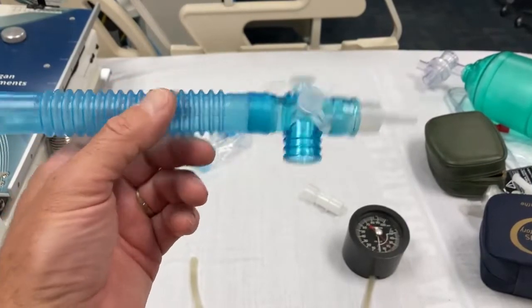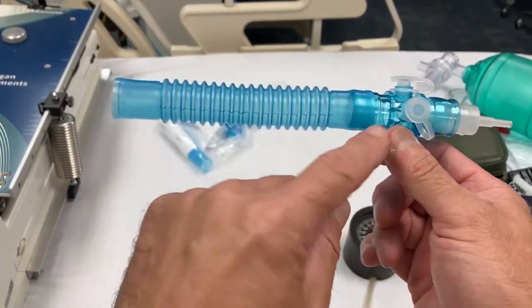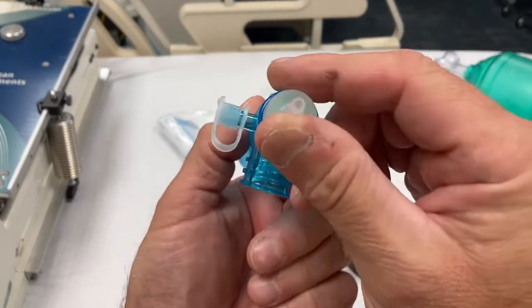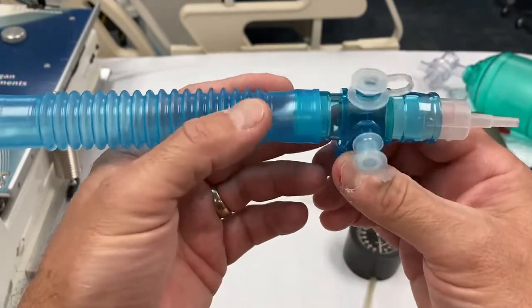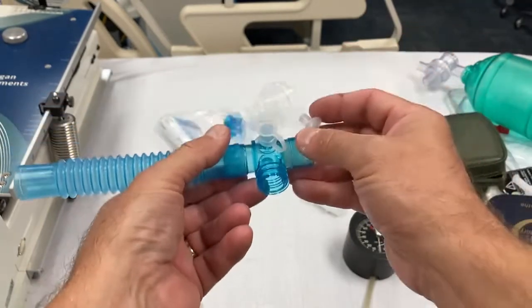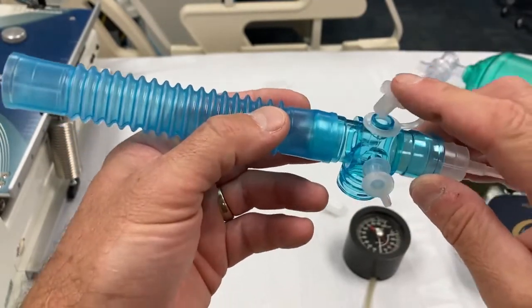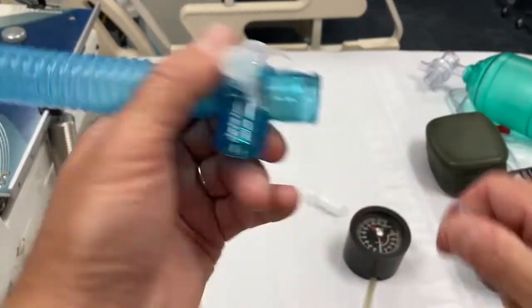Some people will put this whole parameter kit together and get their parameters with it together. So when they get their minute volume, they'll hook the respirometer onto here and have the patient breathe in and out, and they'll leave this nipple on here. Really that makes it so the patient has to breathe through that, and that's not very good. Some people will also open that, and instead of taking them off and on, they'll just plug or unplug that, again leaving a small hole to breathe through. Everybody has their own way of doing things. I like to disassemble it and let them breathe through something that's that size.